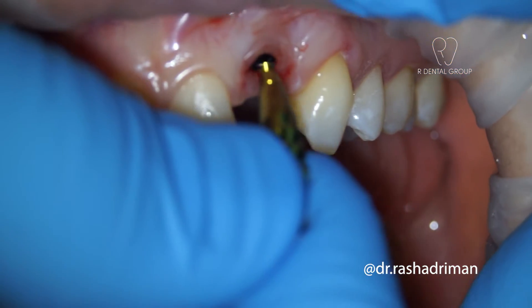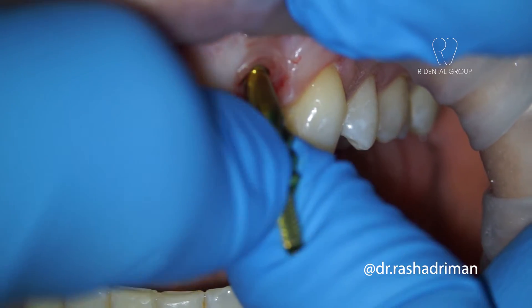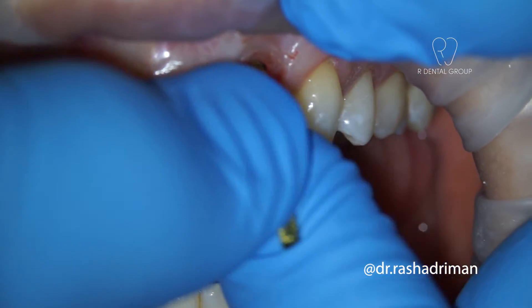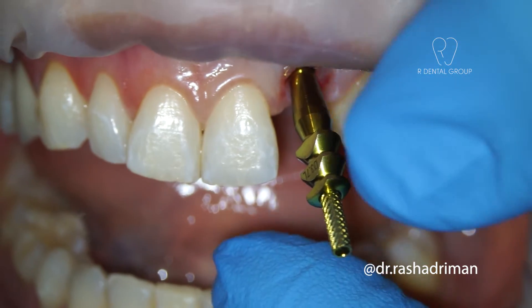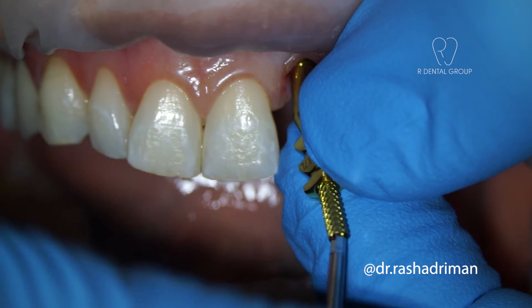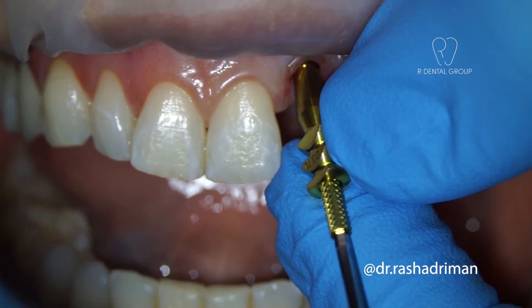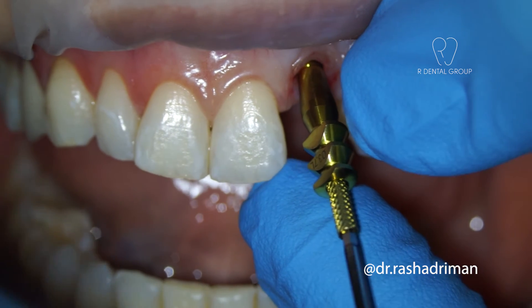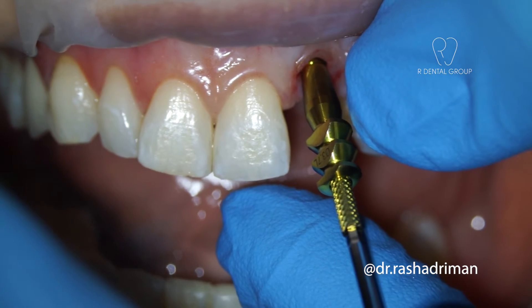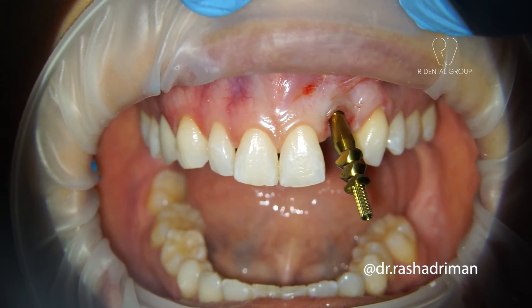I then went ahead and connected this golden jig. This golden jig is simply called an impression coping. It's long, so it's an open tray impression coping — it sticks out of the tray, which you're going to see soon with the blue tray. I then went ahead and checked that the blue tray fits well over the impression coping.